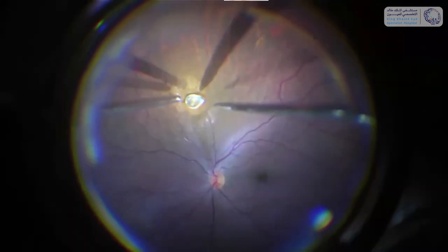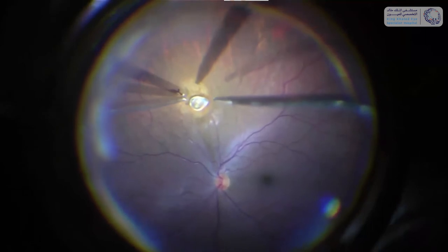When we did the vitrectomy it was very easy to locate the intraocular foreign body. When I scanned with the intraoperative OCT over it, as you can see here, I saw that there was some connection between the foreign body and the retina, so I was afraid that if I just grasped the foreign body I could rip open or detach the retina.